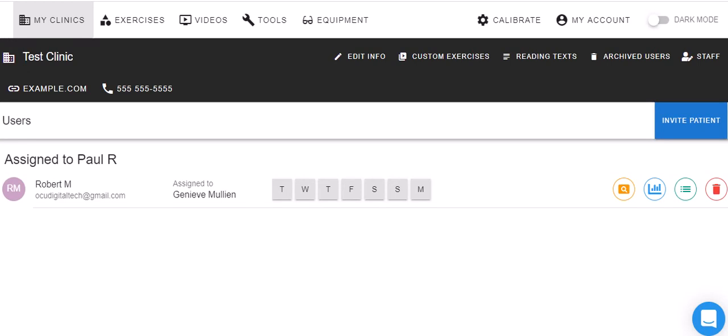Hey everyone, this is just a quick tutorial on how we've been doing remote progress checks using the NeuroVisual Trainer software. Just going to demonstrate it to you. There's some variations that you can do on this particular sequence, but I'll show you what's been working for us. We've done a number of progress checks this way thus far, and we've had some good feedback for sure, and the results have been helpful for guiding the vision therapy experience.